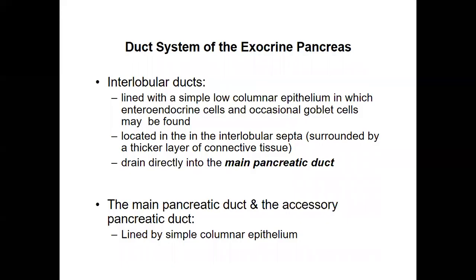The main thing that you have to remember is that the main pancreatic duct and the accessory pancreatic duct, the larger ducts, are lined by simple columnar epithelium. The interlobular duct is simple low columnar, but the larger duct is lined by a simple columnar epithelium.